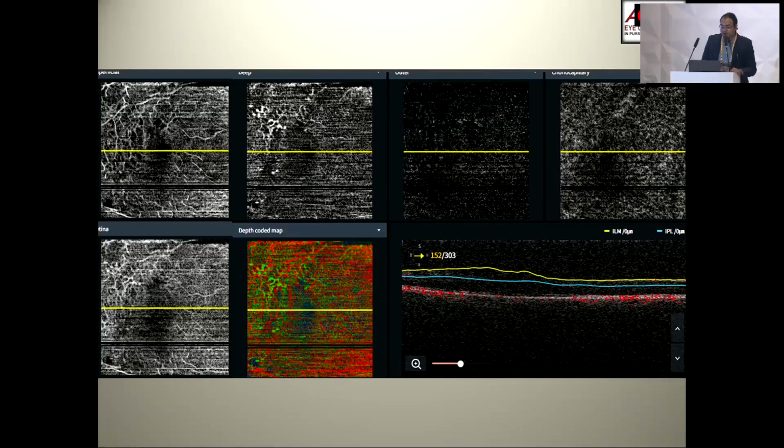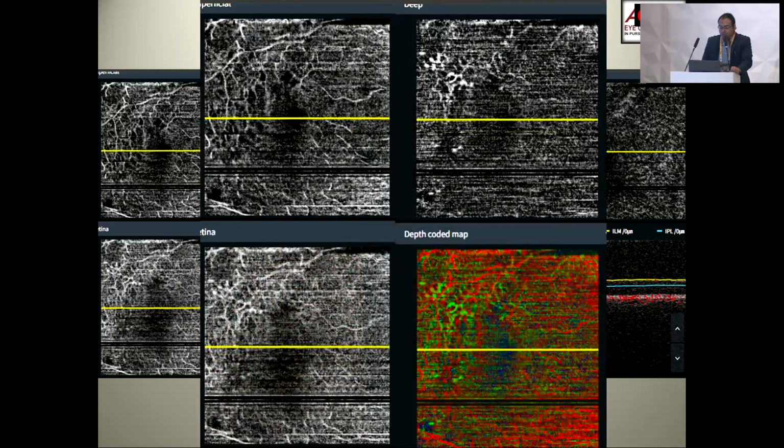Similarly, this is another image. It shows neovascularization elsewhere. So how do you identify whether this vessel has a neovascular component or not? When I zoom this image, you can see that the caliber of the vessels changes. Apart from the surrounding CNP or non-perfusion, you can see that the neovascular tissue is broader. It has more fluorescence. So that is an identifying feature of neovascular tissue.